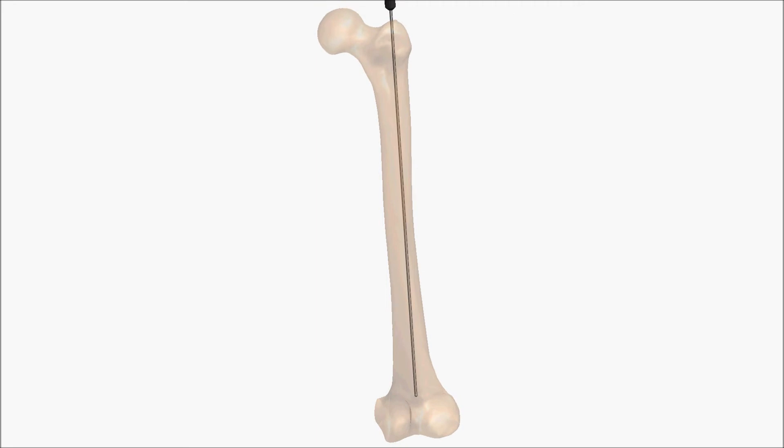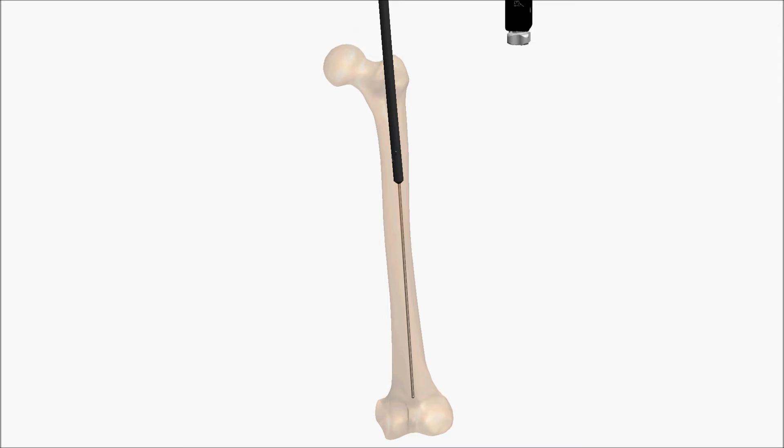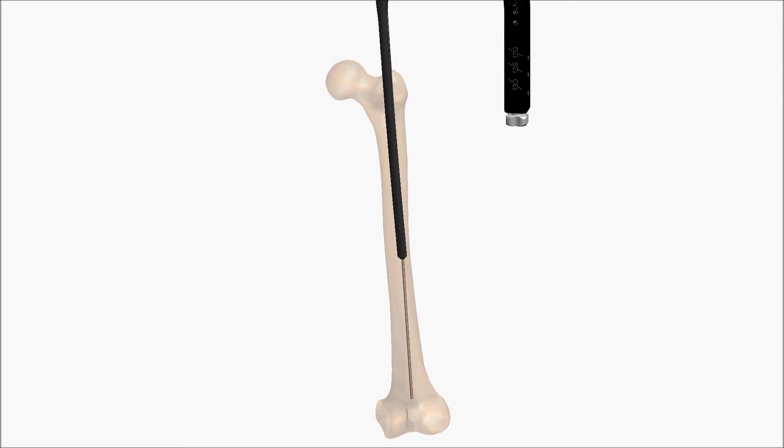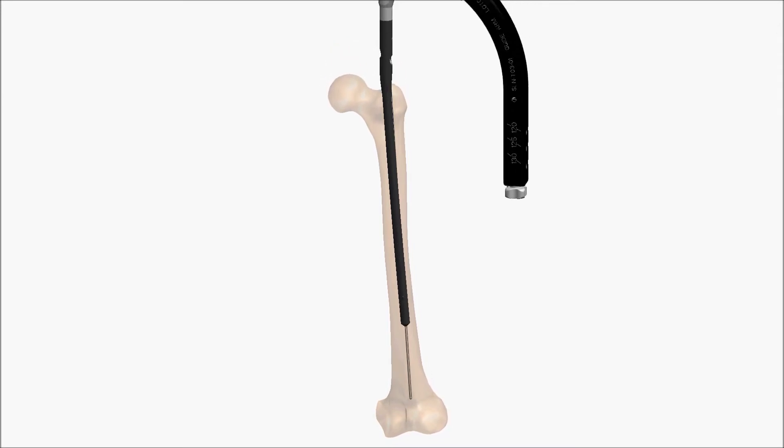With the outer sheath of the guide wire removed, insert the nail over the inner wire. Use steady pressure and gentle twisting motions to advance the nail.